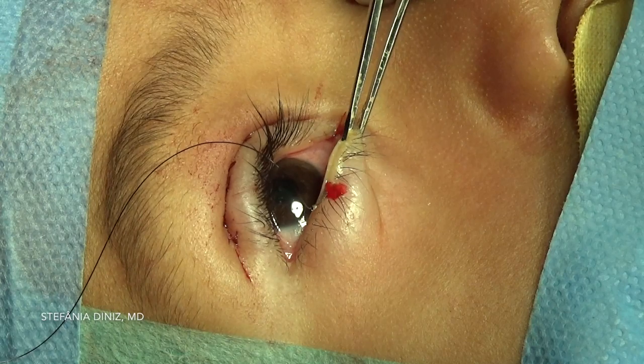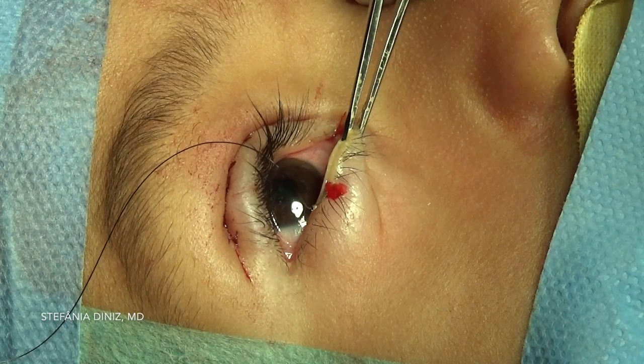This patient will have a frost suture postoperatively to prevent exposure keratopathy. At the conclusion of the case, the eyelid appears to be in good position with a good contour.